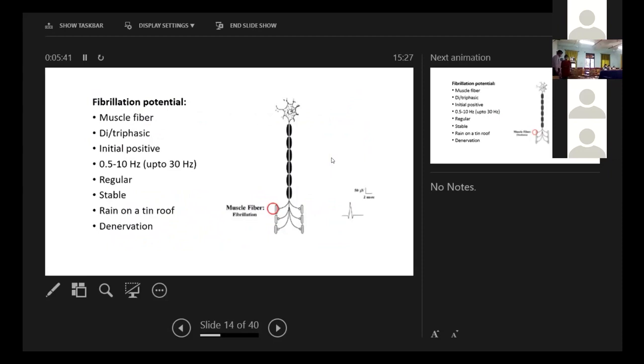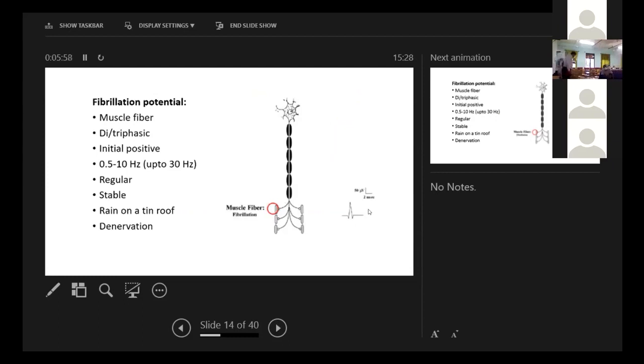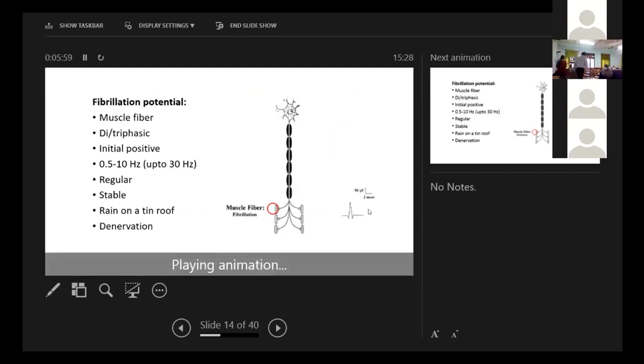Next is the fibrillation potential that comes from a muscle fiber. It is usually regular, stable. It sounds like rain on a tin roof and it means denervation. You see that it comes from this place, the muscle fiber. And it looks like this.